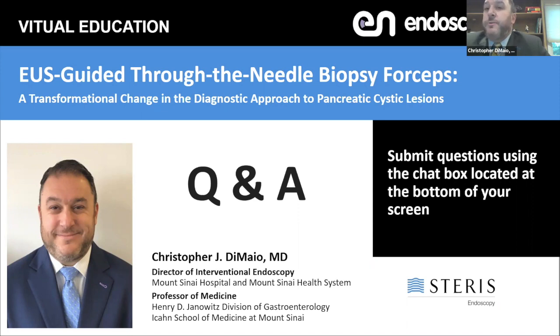There are a whole new class of needles available on the market that are made of nitinol or that have more flexibility than the first generation FNA needles. So that would be one thing to consider: if you're not using a nitinol-based 19-gauge needle, I would consider using that, or maybe some of the other newer needles that are just making their way on the market. That's number one.